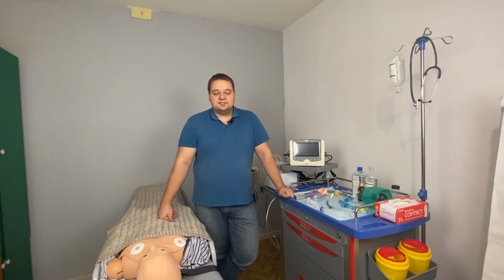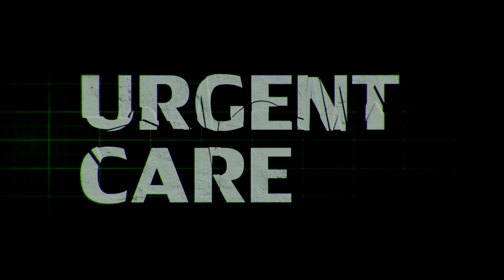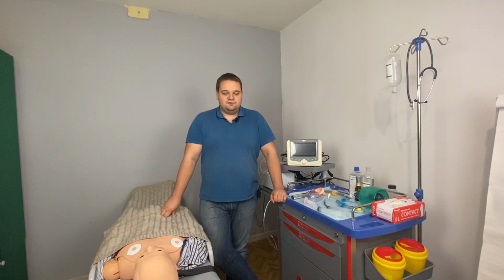Good day, dear viewers. In this lecture, we will discuss methods and equipment used for airway management. First of all, let's discuss some basic definitions for the topic.